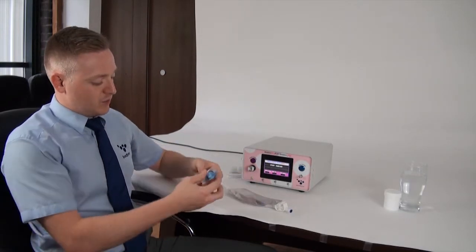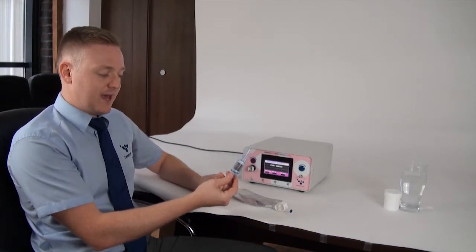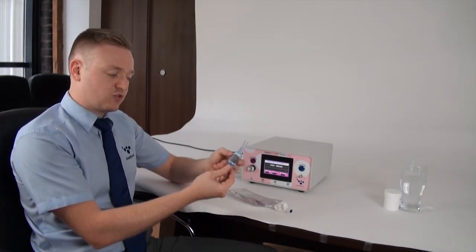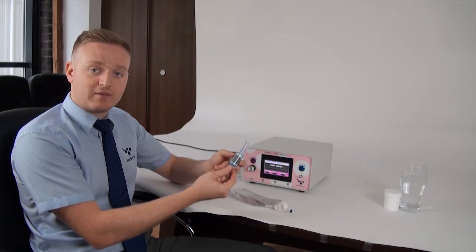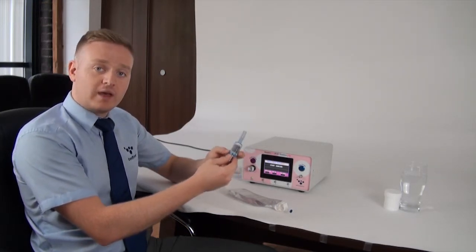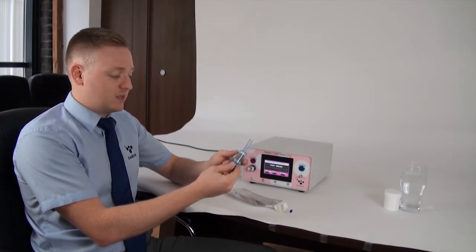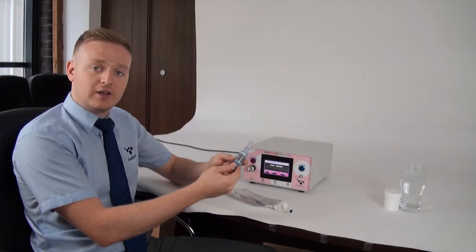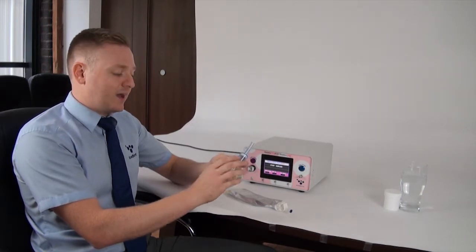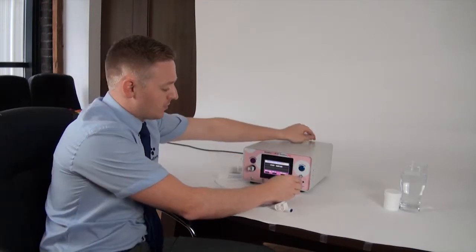For the breath bag test what you need is the filter. The filter goes onto the front of the machine and has little drying balls in there to take any moisture out of the breath. They start off orange and then when they're spent or used up they will go dark green, so when they go green you need to change the filter over. Approximately 150 tests until they go green. So we'll pop that onto the front of the machine there.